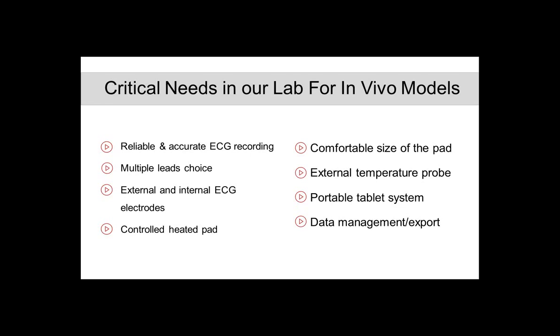You can use either external or internal electrodes. That basically means you can either poke the mouse with the electrodes and record like this, or if you don't want to induce any more stress to the mouse, like post-MI for example, you can just use the external electrodes, which are built into the actual surgery pad. The surgery pad has a heating system, which is awesome. I like it the most. That helps our mice maintain their temperature, and we know that temperature could have been one of the causes of post-MI deaths in the early period before these systems.